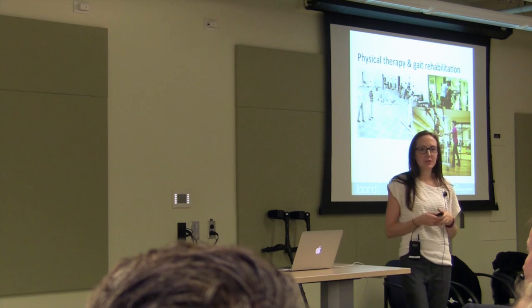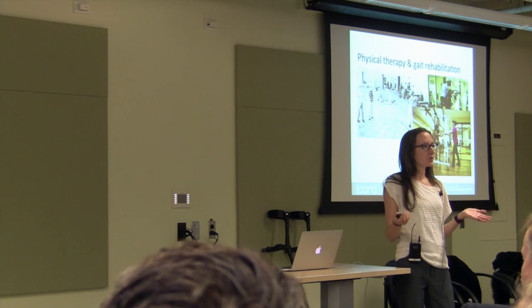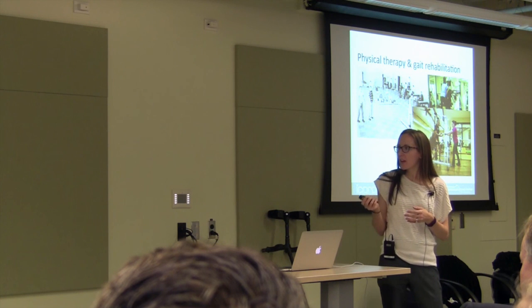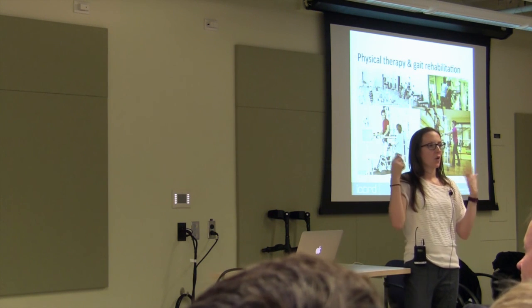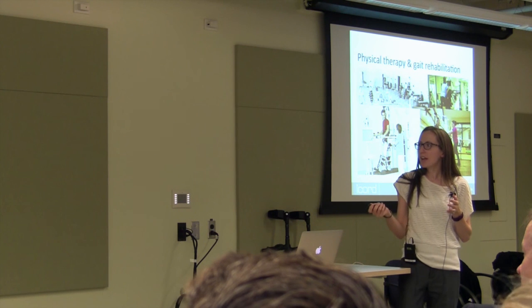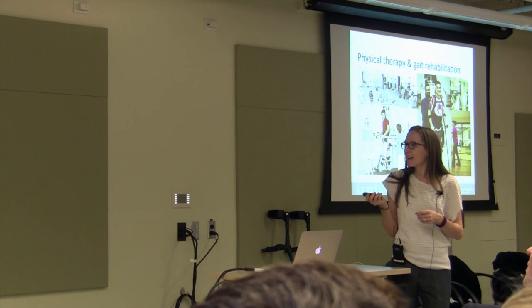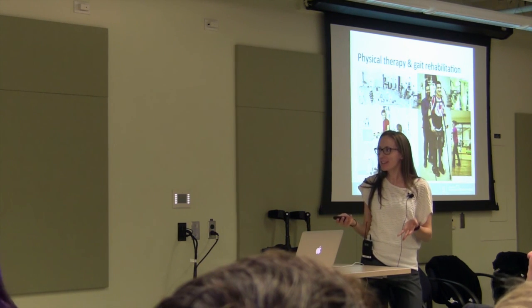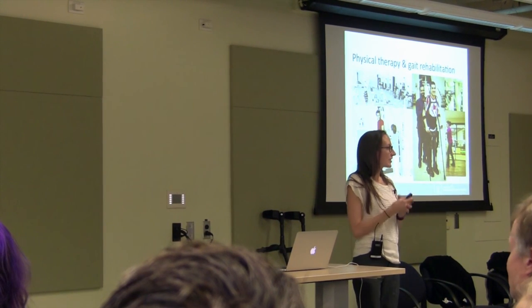Then other devices were further developed, where we still have the body weight support, but the person is able to walk over ground, and the therapist is still there to help their legs move through the steps. Now we have devices like this one, called the Lokomat, with an overhead body weight support system and a treadmill, and robotic legs attached to the participant to do the walking movements. And now we have similar devices, but for over ground. So there are many different gait training options out there. As Jaynie was pointing out, these new robotic tools are exciting, but they may not be the best therapy option for everyone, depending on the criteria you need to meet.